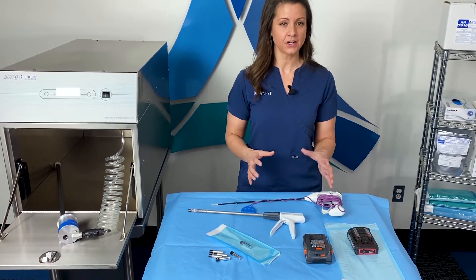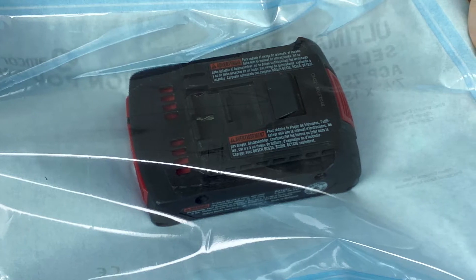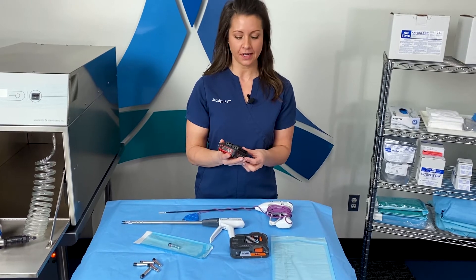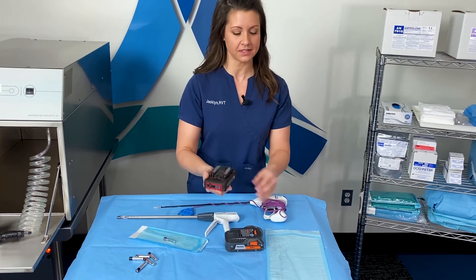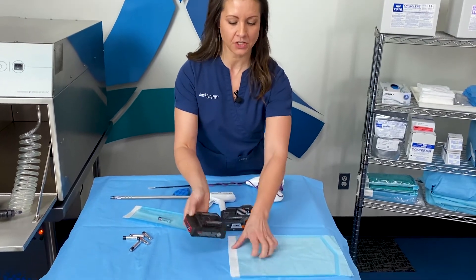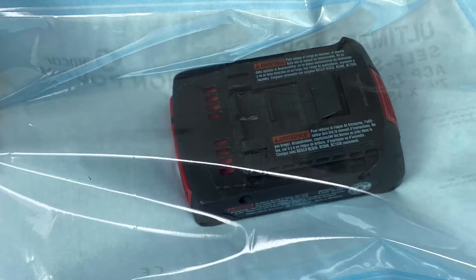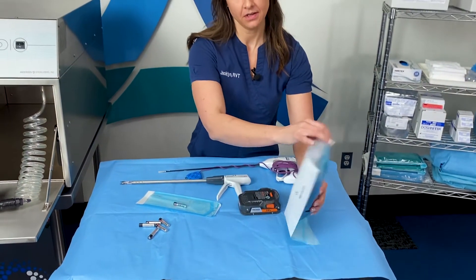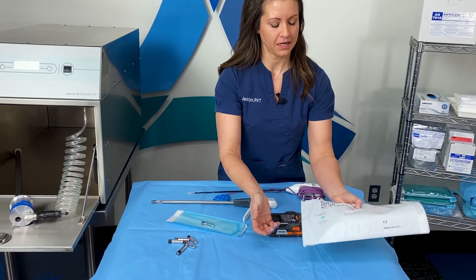Batteries can be sterilized — we get a lot of questions about that. Battery packs are often the external part of a drill or saw that comes into a sterile field. As long as this is separated from the instrument itself, it can be sterilized. You would detach it, place it into a pouch, and seal that. It can go in with the rest of your items in the sterilizer cycle as long as it's separated. There's also a color change indicator on the back of this pouch.